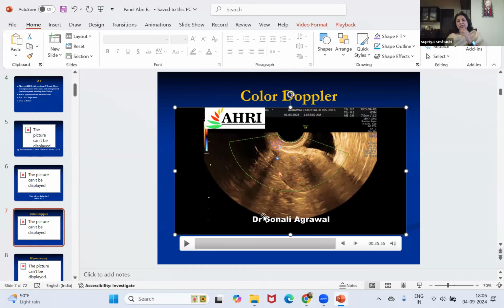So here, the message from what I've seen is, when there is a cystic space in a postmenopausal endometrium, even if it's a single cystic space, think of polyp unless proved otherwise. With a cystic space, it is more likely that this polyp will not be malignant, will be benign. Of course, there are other factors also to be taken into consideration.